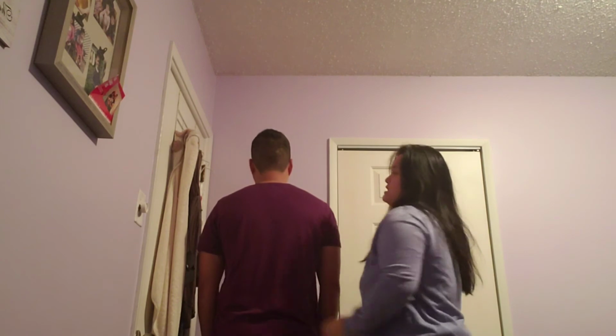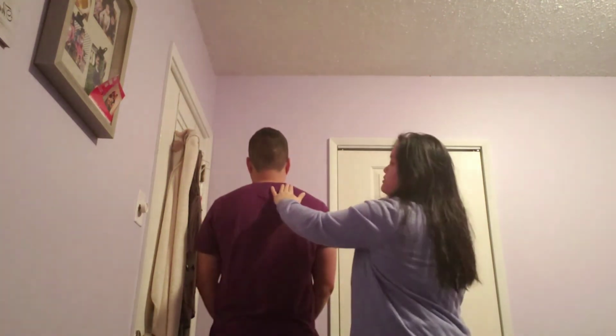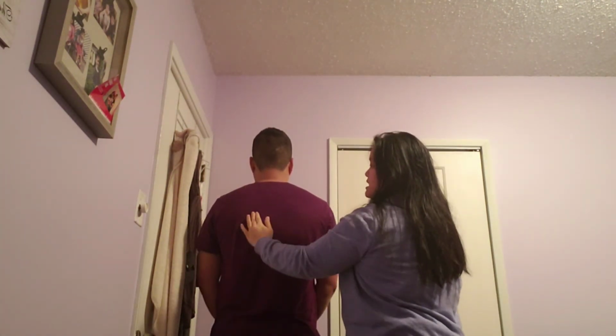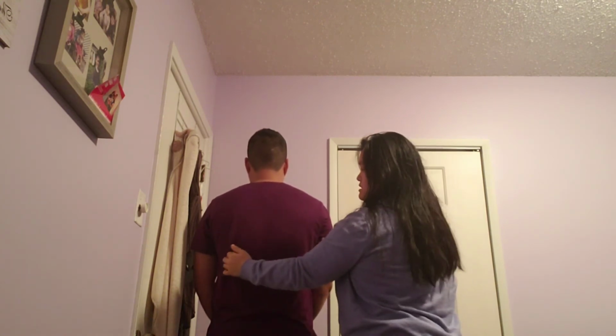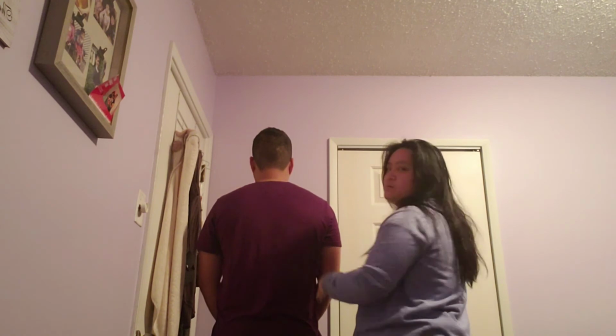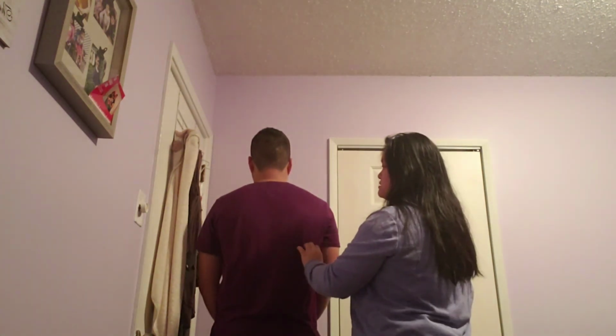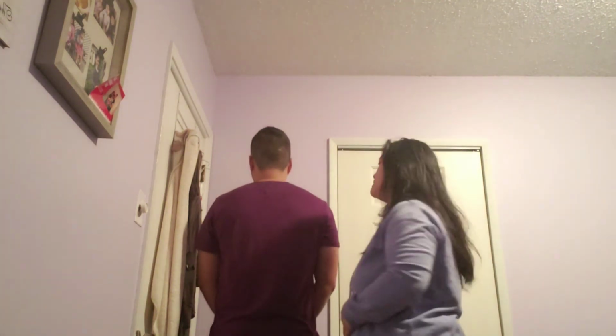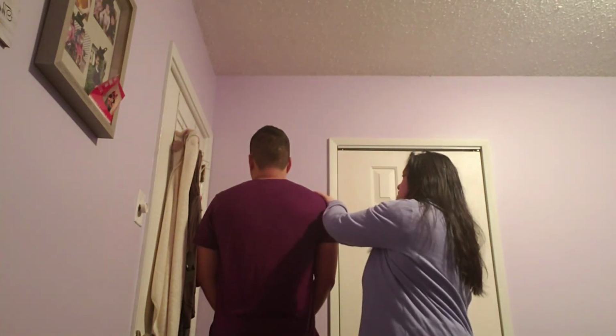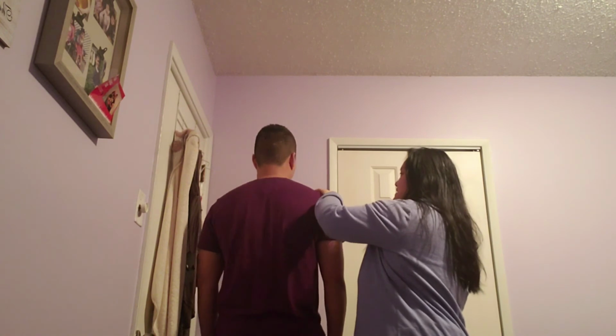So also the back, starting from the top, and then moving across, and then down, across, down, across. You might want to do about 10, and each time telling the patient to breathe in deeply. Turn around again.